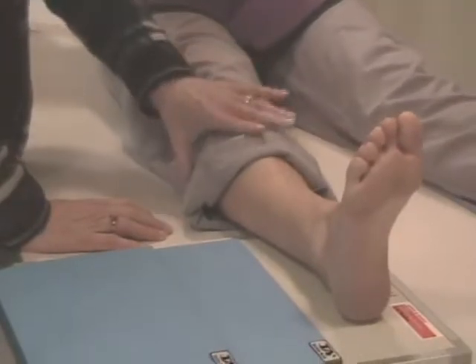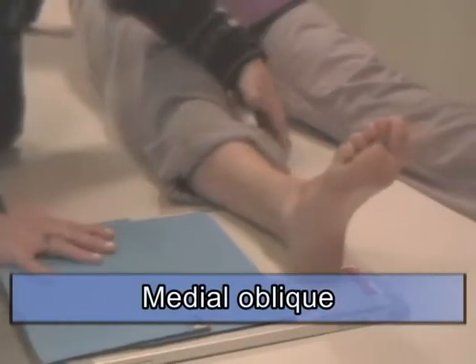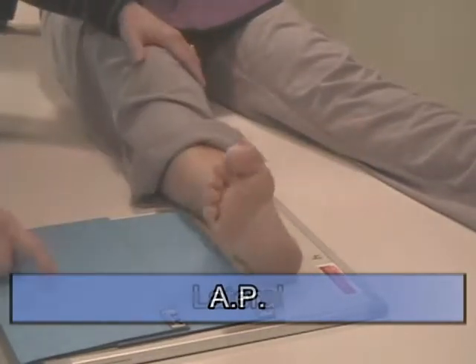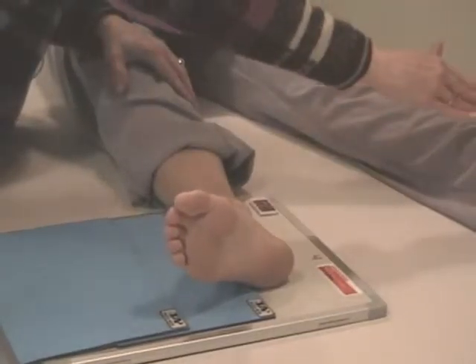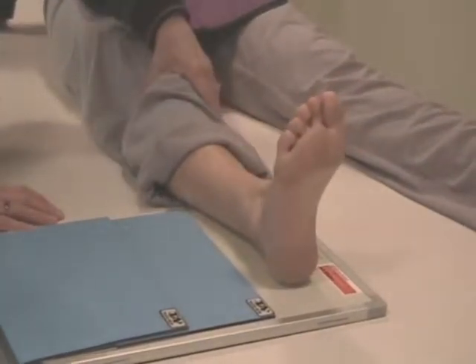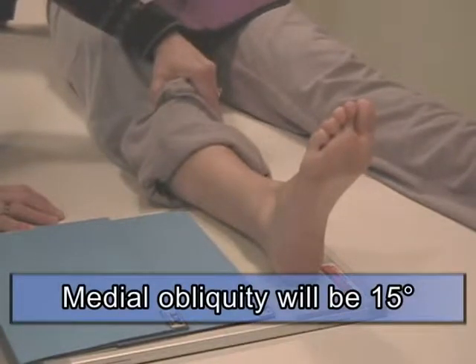Okay. We're going to do 3 projections. We're going to do a medial oblique, and then in the center section we're going to do an AP with the foot straight up, and then we're going to do a lateral on this projection. Lateral goes off, and the oblique goes off on that side. Okay. The medial obliquity will be approximately 15 degrees.